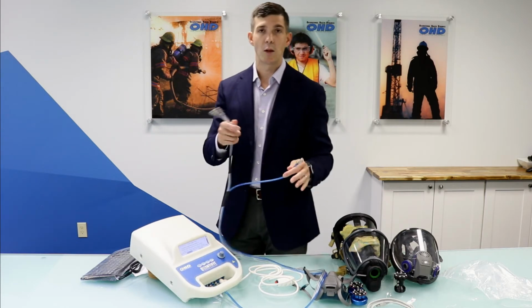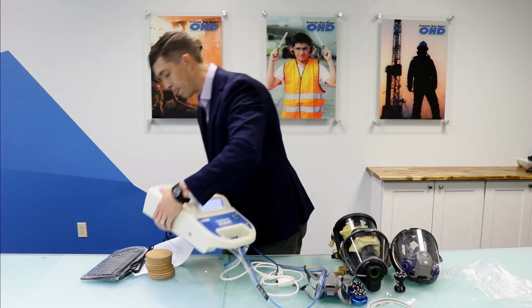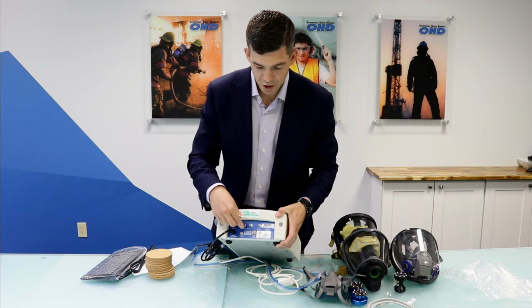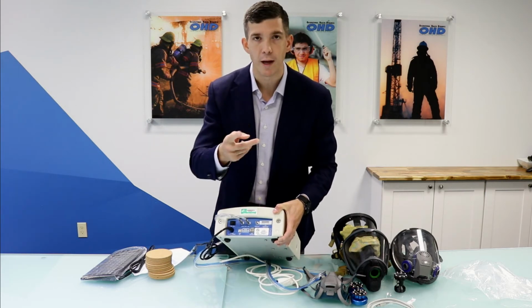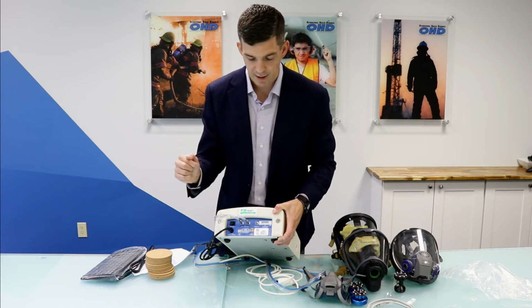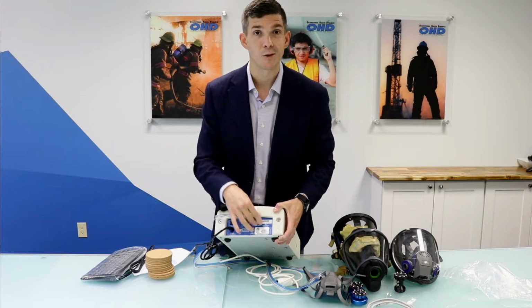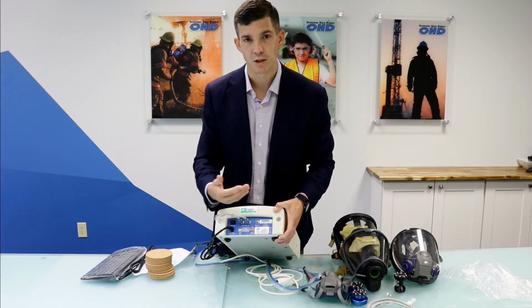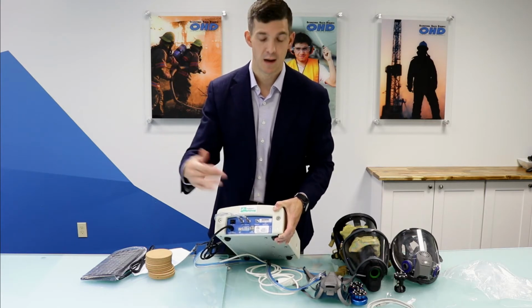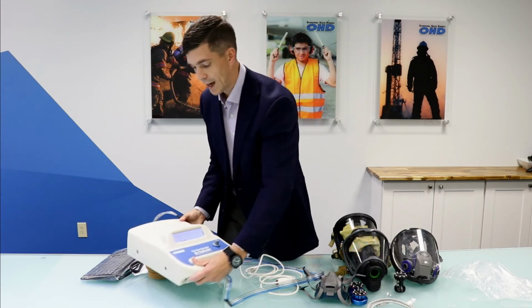So the next thing for calibration is your two clear tubes will connect to the back of your instrument where it says dual tube cal, okay? Now, one question we get a lot, and these can go either way, by the way, you can flip them around. They don't have a specific way they go, just connected there. There is an exhaust port that's there. Obviously, nothing goes on the exhaust port, but we will have questions every now and again about what connects to that. Nothing. That's for exhausting the air out of the back of the instrument. So that's your connection for daily cal.